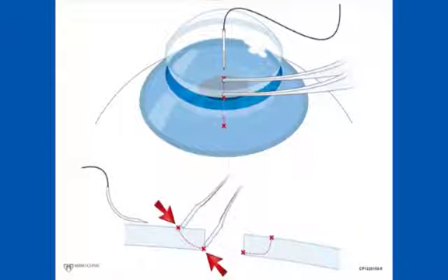At this point, you've positioned the forceps to describe the intended point of entry and exit of the needle while also ensuring that the needle will pass along the intended radius. You've also set things up so that if the needle comes in too flat, it will hit the deep forceps tip and give negative feedback that tells the surgeon to reorient the line of the needle's passage so that it goes under the deep forceps tip. Now we're ready for the needle.